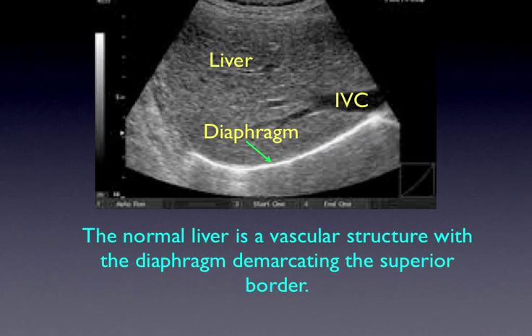Now remember that when we go from the superficial anatomy, the skin and the subcutaneous fat, and we go up to the level of the chest, since we're aiming the probe up, the beam is going up, the image will appear on the bottom of the screen when it's further into the body.